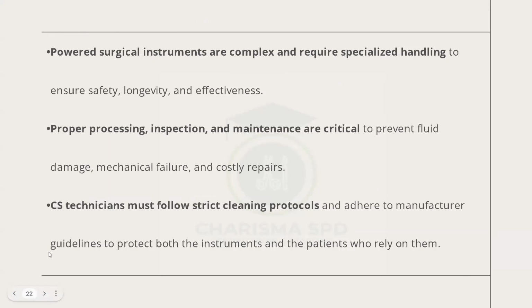Okay, powered surgical instruments are complex and require specialized handling. We saw that already. Proper processing, inspecting, and maintenance of them are critical.